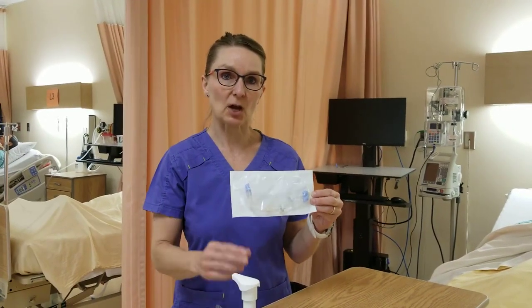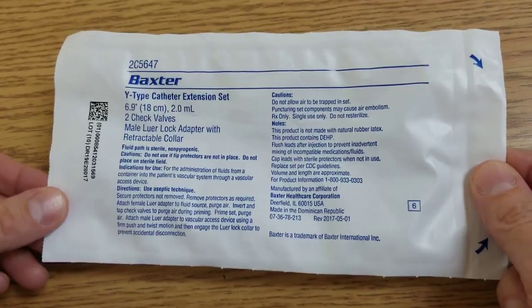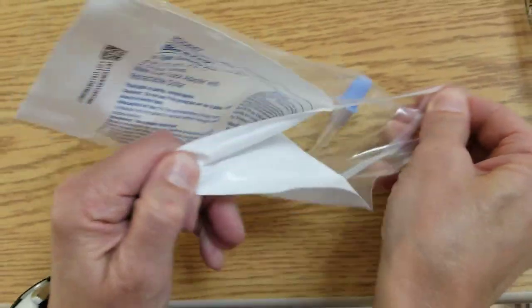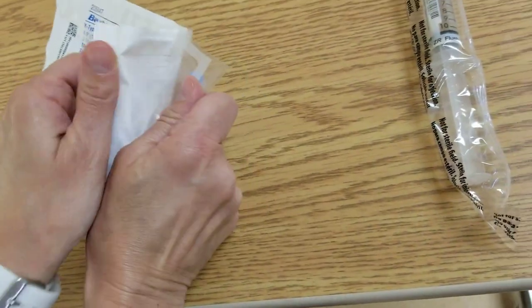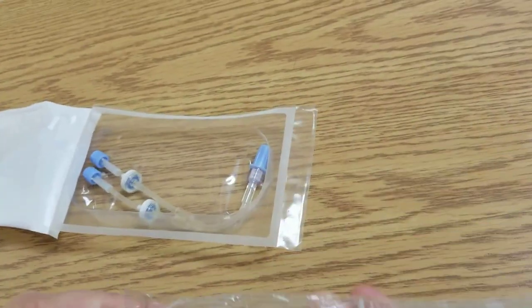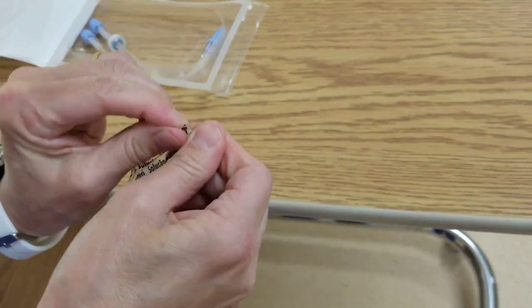Today I'm going to show you how to flush a Y-type extension set. So I begin by opening my package and I'm going to keep it in this bag, and then I'm going to open up my pre-flush.